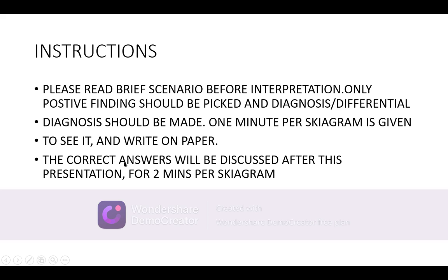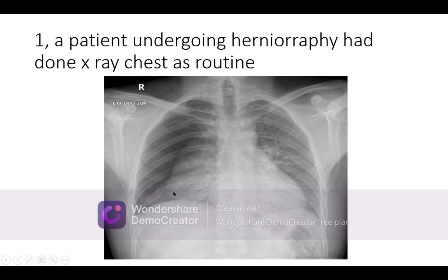The correct answers will be discussed after this presentation, at 2 minutes per X-ray. For the answers, there will be another presentation which will be uploaded. So take your time and do it, 1 minute or 2 minutes.